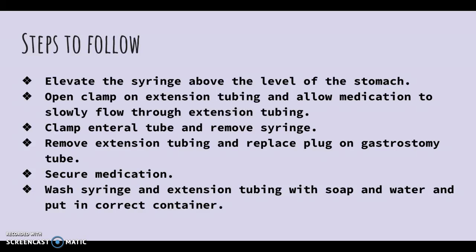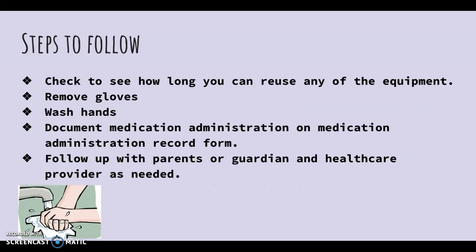Make sure that the medication is secured, and then wash the syringe and extension tubing with soap and warm water and put it in the correct container that it belongs. Check to see how long you can reuse any of the equipment. Some of it you might be able to use longer than others, so it's good to know this information. Then remove your gloves and wash your hands.